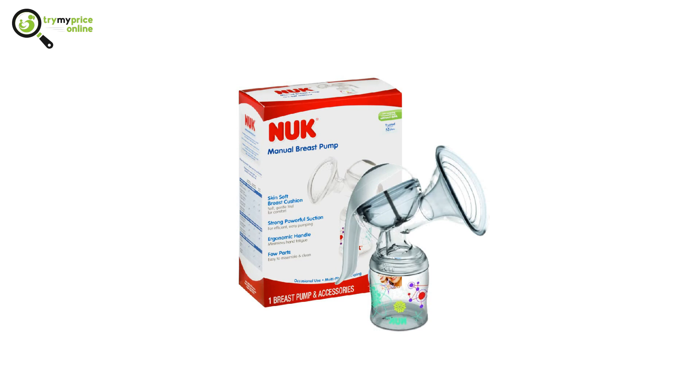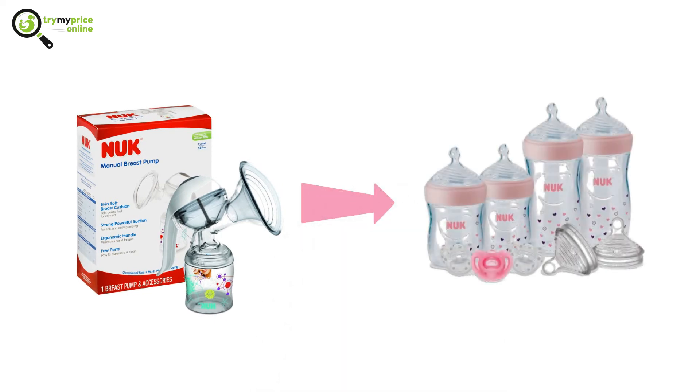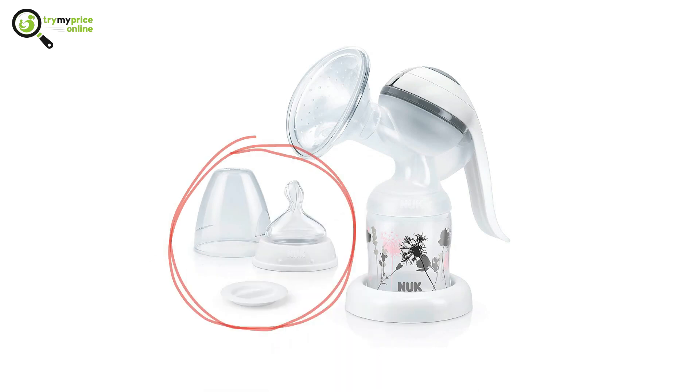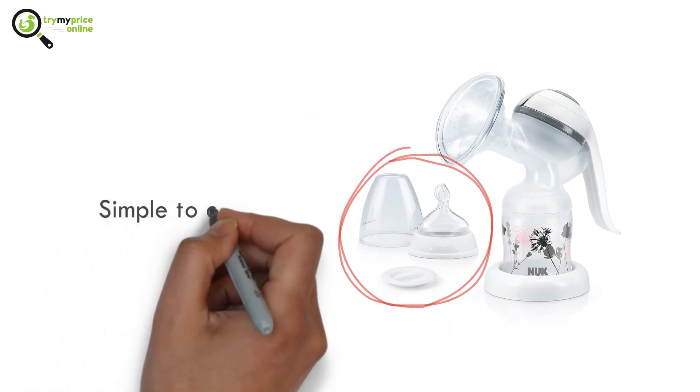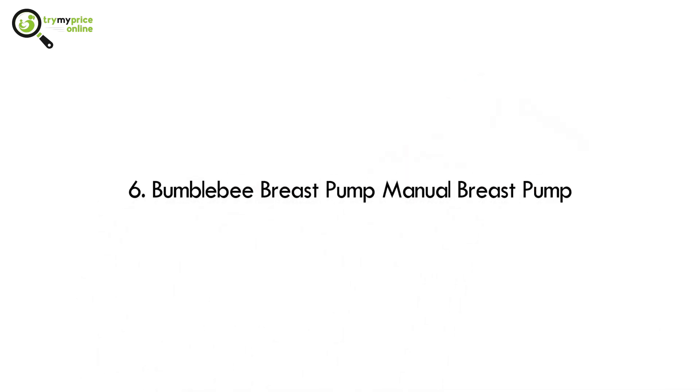Number 5: Nuk Expressive Manual Breast Pump. Mothers can change both the speed and suction of this pump as they use it, and the milk pumps straight into any Nuk bottle that you attach. The pump weighs just 5.5 ounces, which feels like nothing in your bag. There are few parts to this pump, which makes it simple to clean.